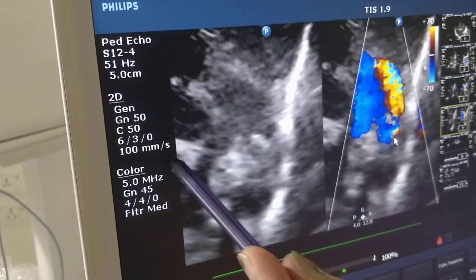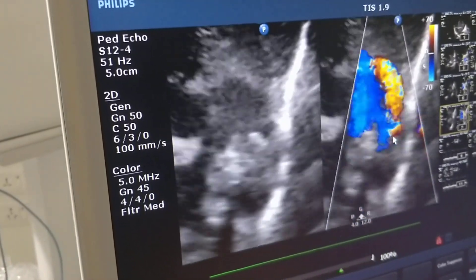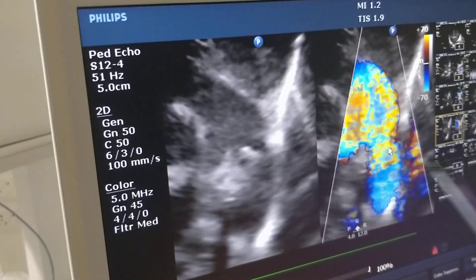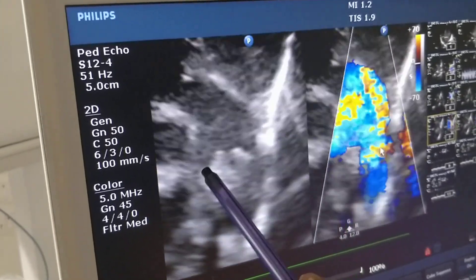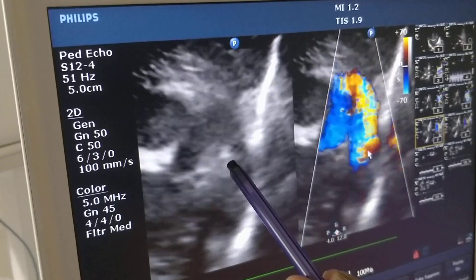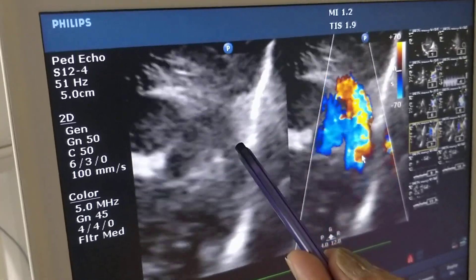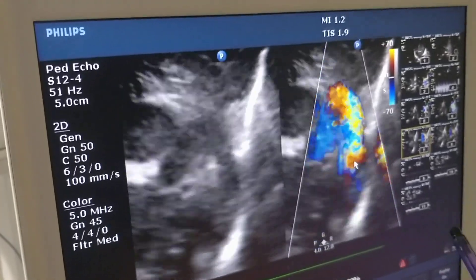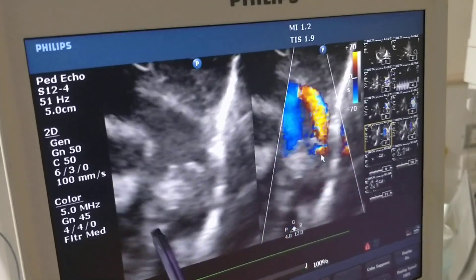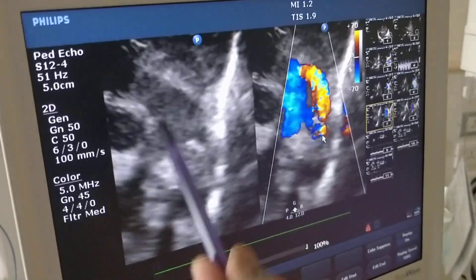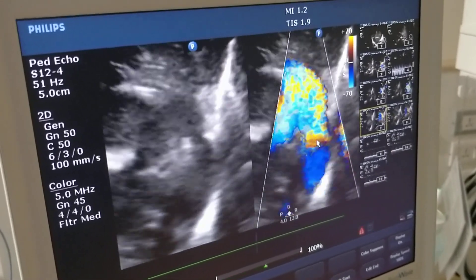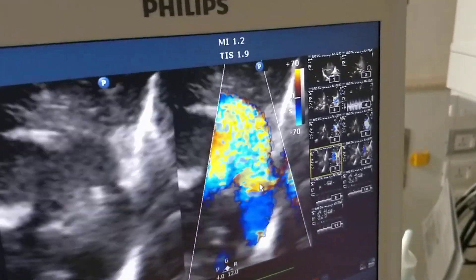This parasternal short axis is also called the great vessel view, where you can see the root of the aorta, the pulmonary artery, the right pulmonary artery adjacent to the root of the aorta, the left pulmonary artery, the ductus arteriosus, and the descending aorta. This is on the grayscale 2D echo.